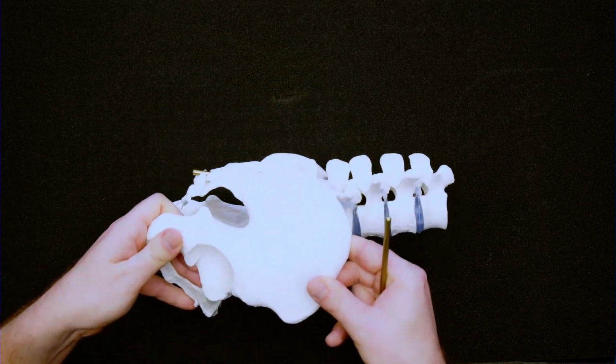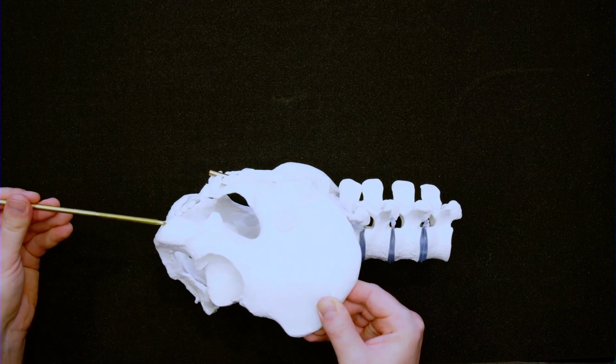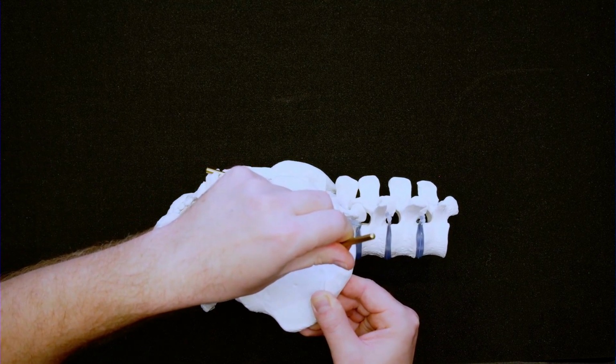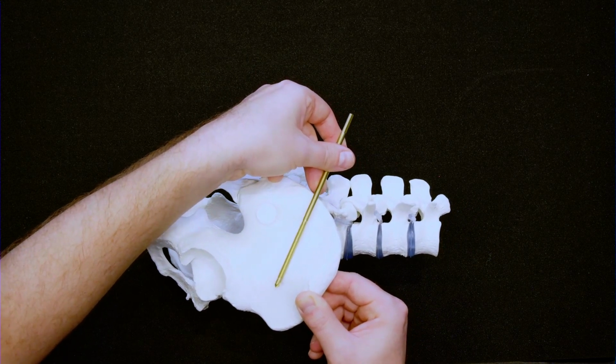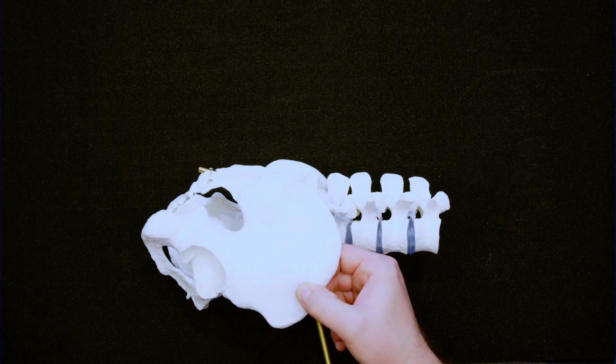In this case, you position the patient in lateral decubitus, and now you still can access the posterior column, you still can access the pubic ramus, you can still access the iliac wing. However, usually it's more difficult and challenging from posterior in these cases, so usually go from anterior in these cases.